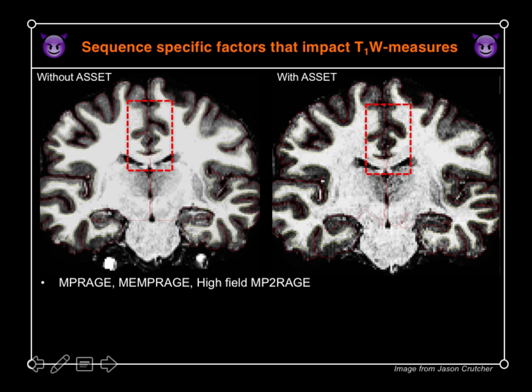So it's also a problem that there are some regions that are more affected by using an acceleration factor versus other regions, right? So these are things that you need to, I think, be aware of.